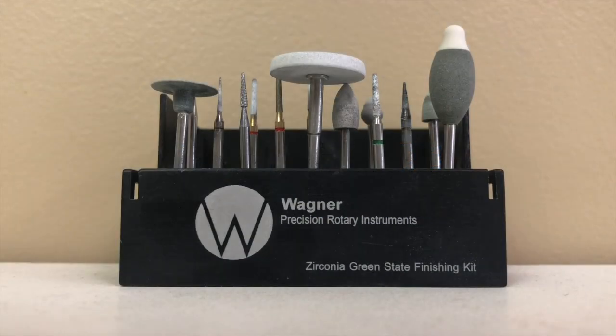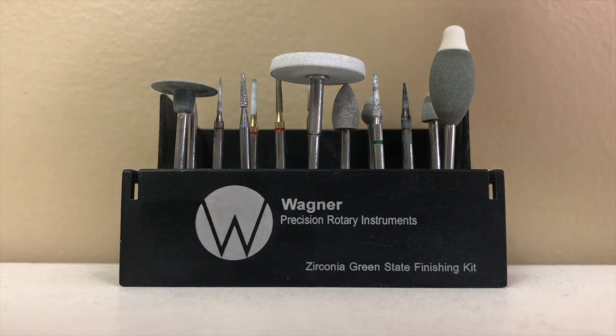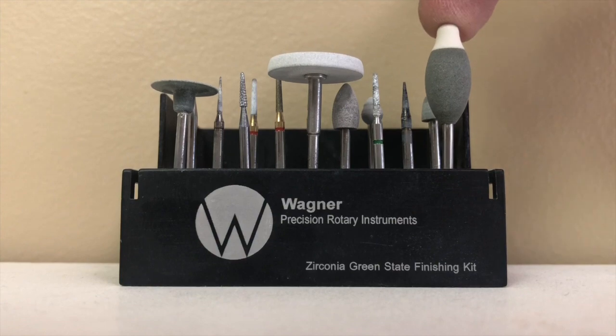Hi, this is Bill Atkison with Bellavita Dental Designs with your Tekken 2 on finishing Green State Zirconia. This is my Wagner kit and I use these three main burrs in my Wagner kit: my cut off, carbide cut off, my silicone burr, and my GS contouring stone.